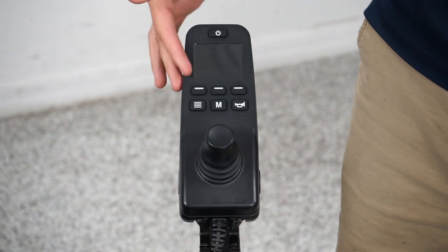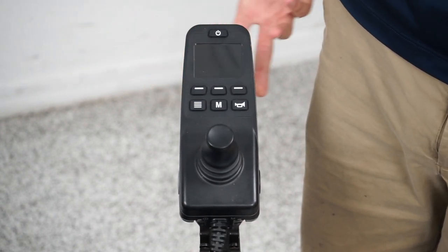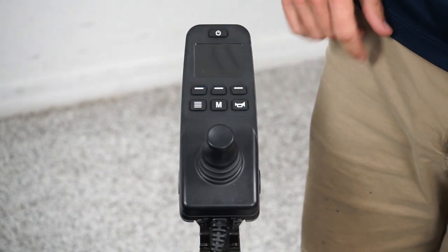Today I'm going to show you how to use the Q-Logic E joystick. This is similar to the Q-Logic joystick, but it's a much more simplified version with more physical buttons.